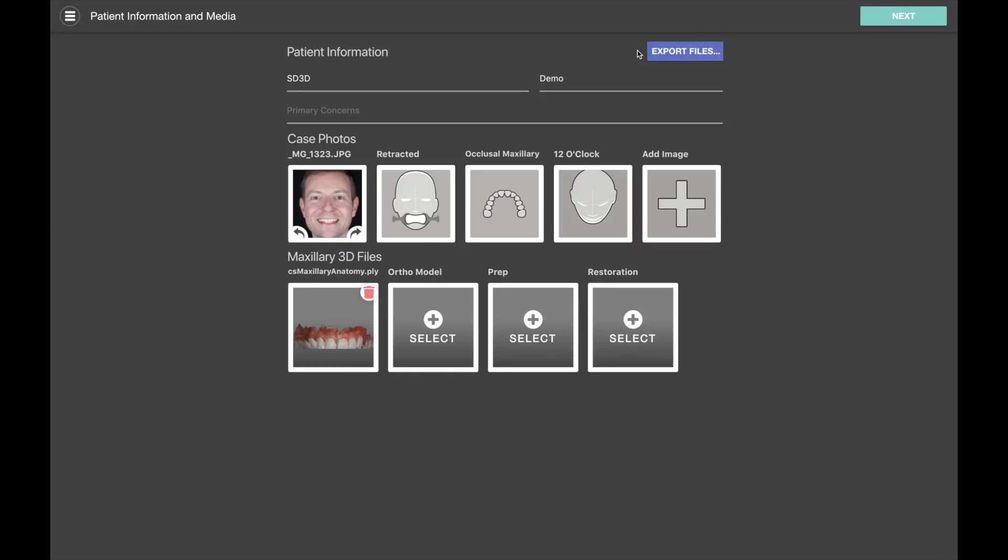Just a quick note about this export files button. If you share your Smile Designer case through the cloud service in the case gallery, there's a share button where you can share your case with any other Smile Designer premium cloud user, including your lab.